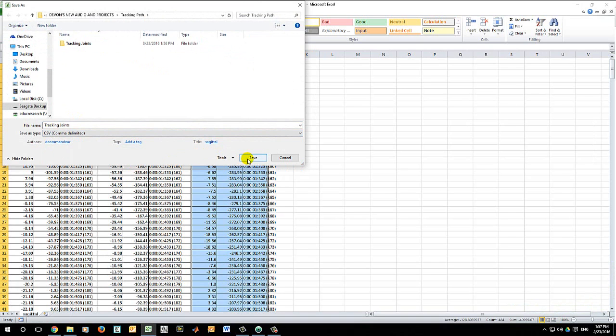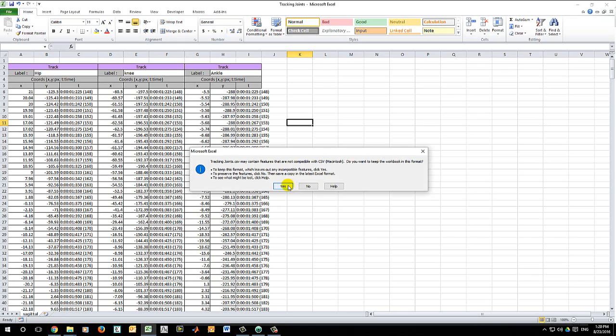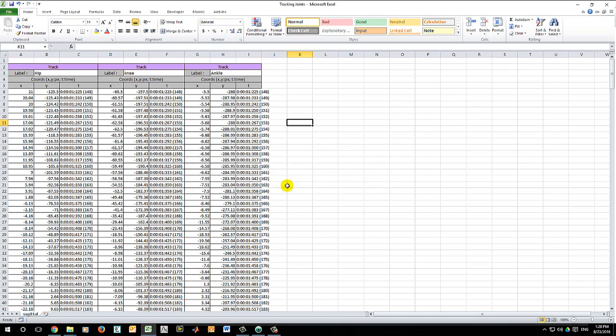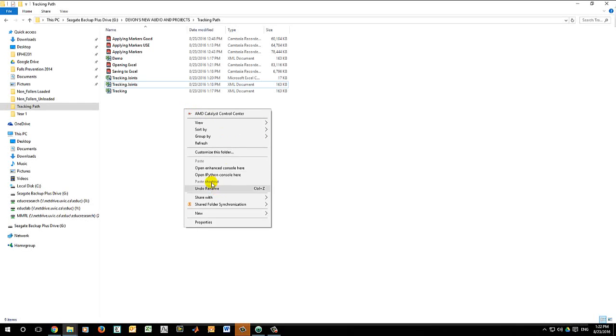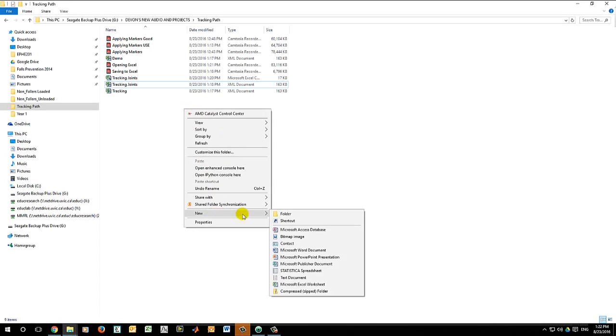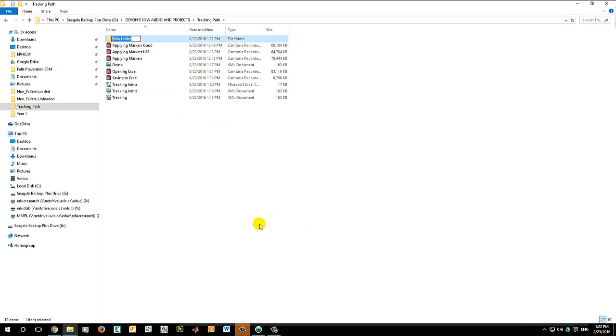Now exit the spreadsheet and don't hit Save as you've already saved it in the new format. Finally, you can run the data through the Analysis program. Create a new folder on your desktop that only contains the CSV spreadsheet.